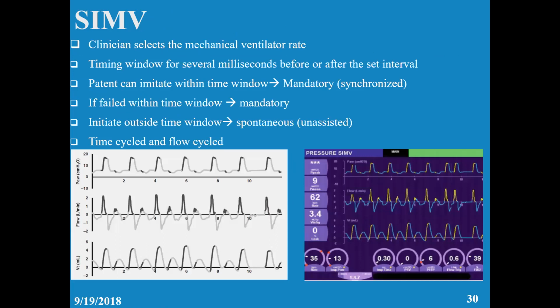Now, what about SIMV? Why is this SIMV? Anybody can tell me? So it's only mandatory, there is no assisted, but it never gives a breath against the patient.